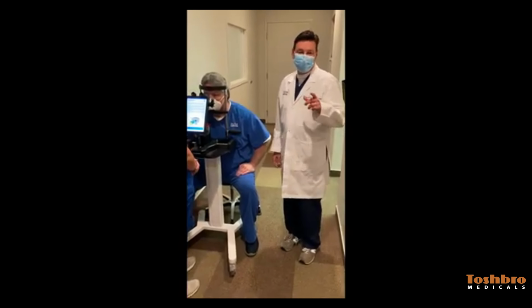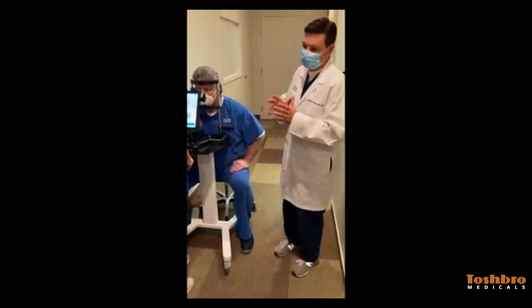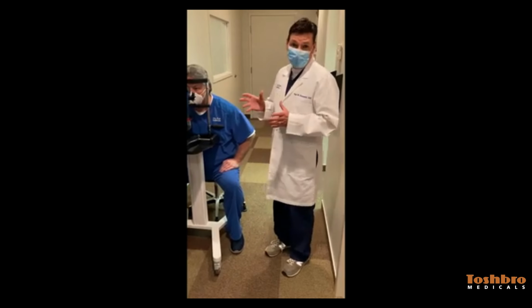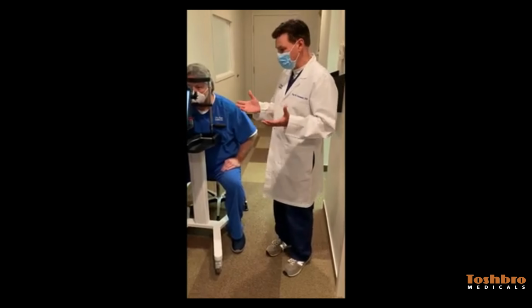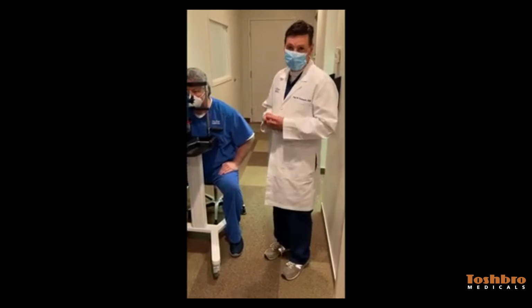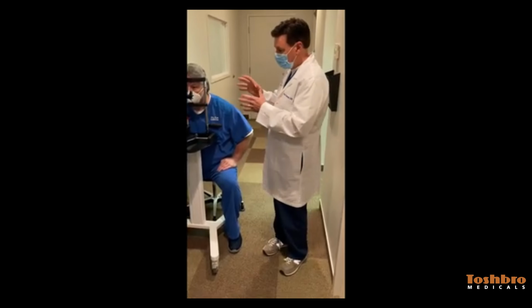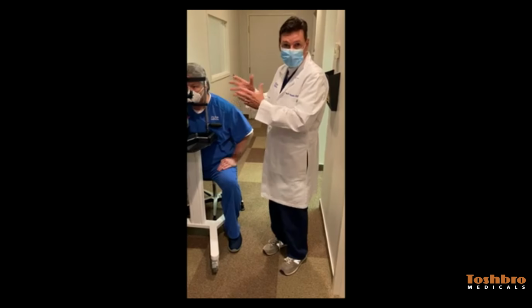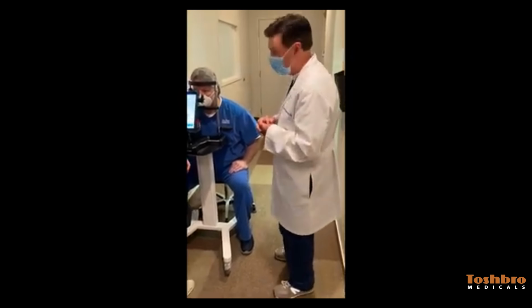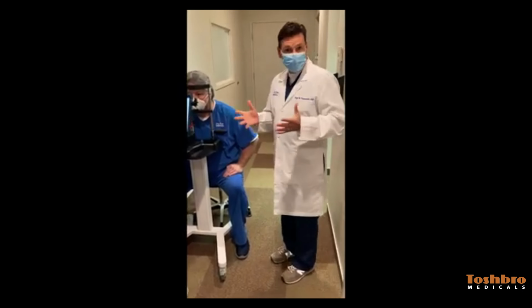Today I'm going to take you through a technology I'm extremely excited about known as the MuCheck. It's a wonderful meibography system that's very simple, but also a great patient education tool. Beyond that, it's not only important as meibography, it takes into account the data, allows us to do a symptom score on the OSDI-6, which gives us a lot of the key symptoms related to dry eye, and allows me then to take it and educate the patient, give us a grading of where they're at based on the Pult score. That's a MIBO scale, as is listed here, but Dr. Pult has done a lot of the work in terms of creating this and validating it, and so we're lucky to get to present this to you today.